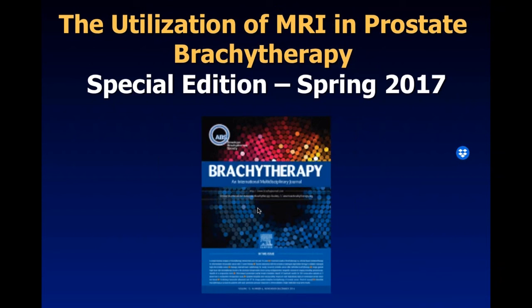What we have done here at MD Anderson is extend the utilization and improve quality in brachytherapy by incorporating better technology through MRI. And while many look at MRI as increasing cost utilization to a procedure, what we have demonstrated is less cost because we're able to cut out elements of the workup and the procedure by utilizing MRI in simulation, treatment planning, and post-implant assessment.